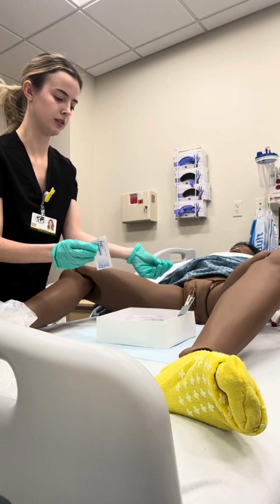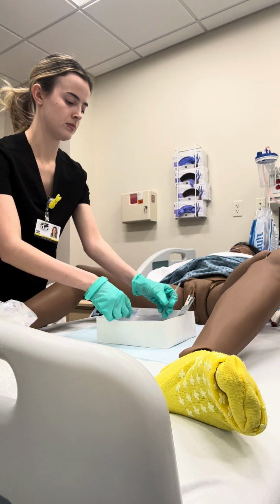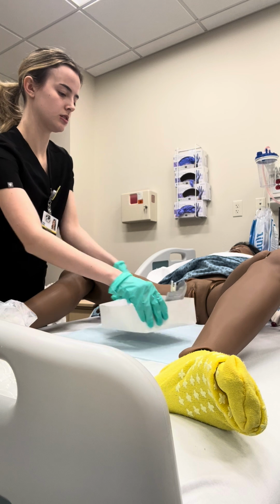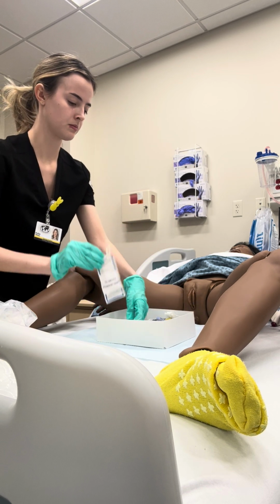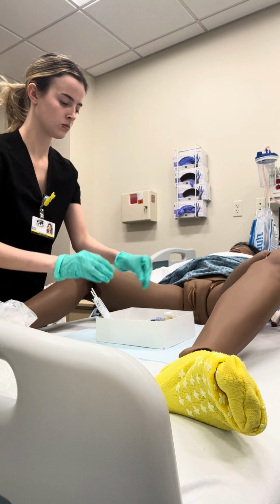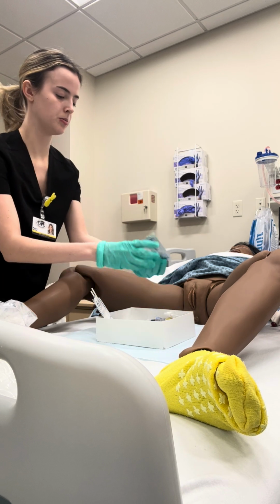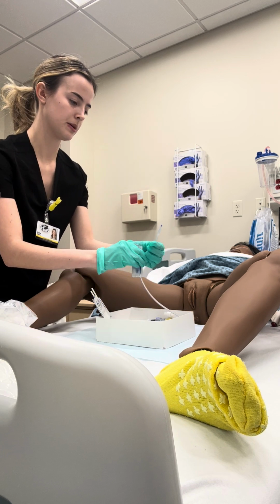And I would open my lubricant. Actually gonna turn this way. Open my lubricant and I'm going to look at my catheter.